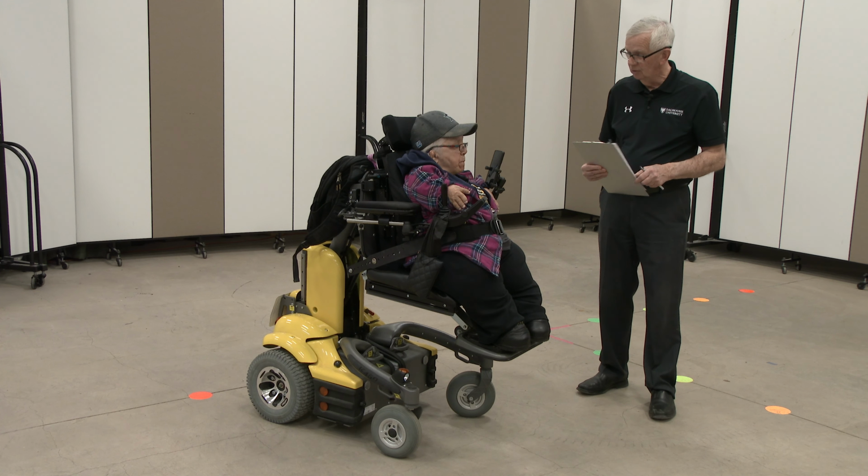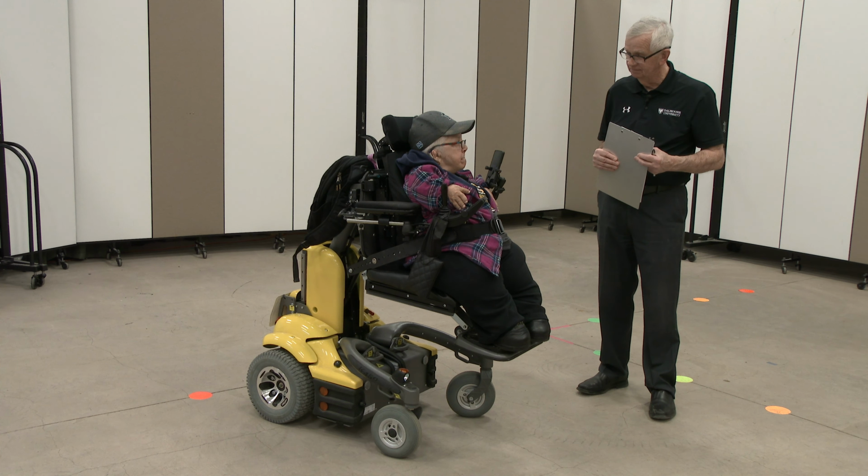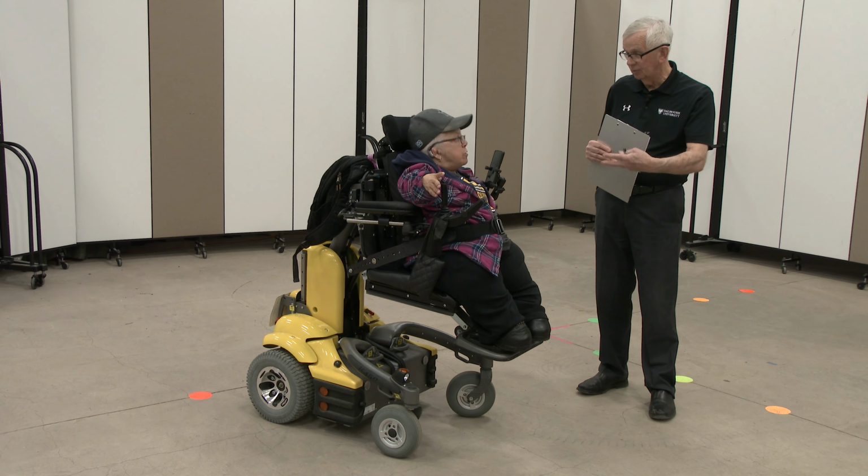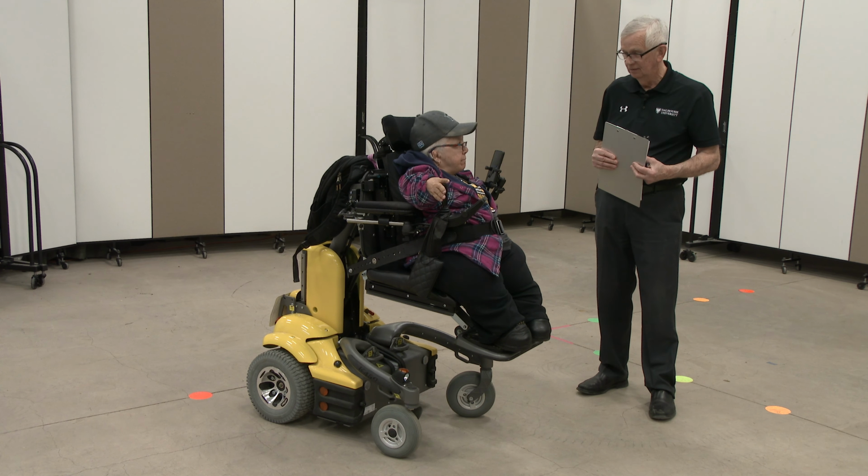Great. What do you use the tilt for mostly? To get off of my back side. So to relieve the weight from your sitting surfaces. Yeah. Very good. Thank you.